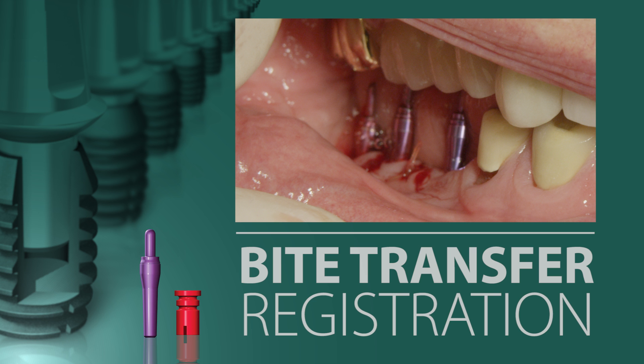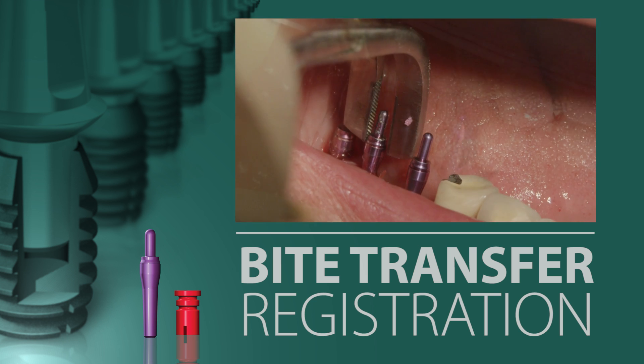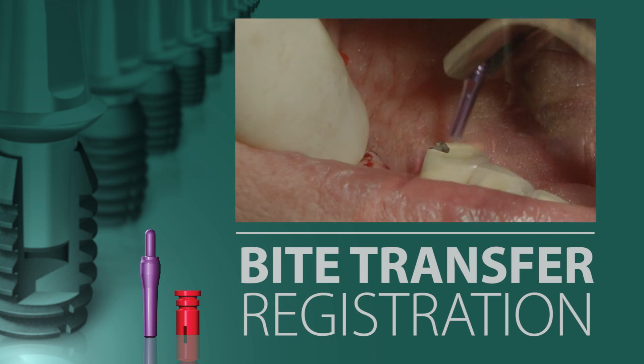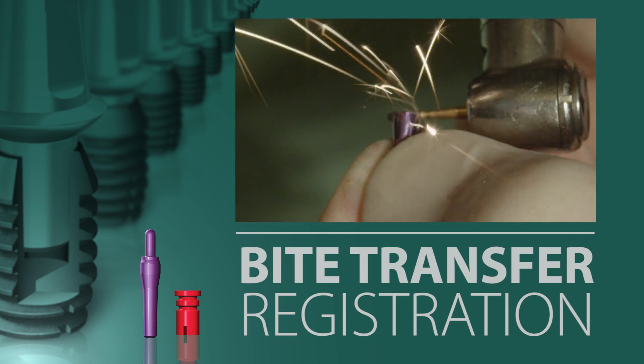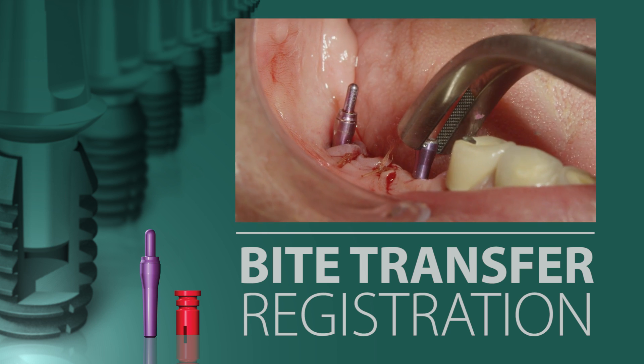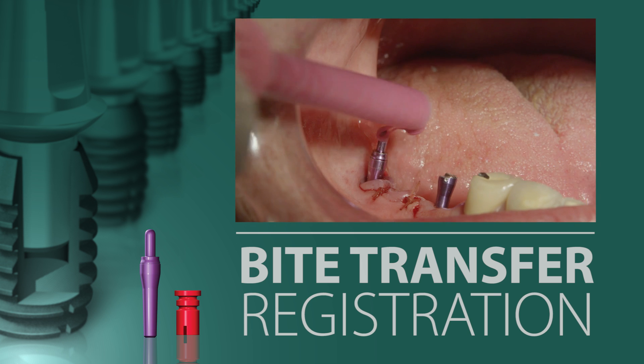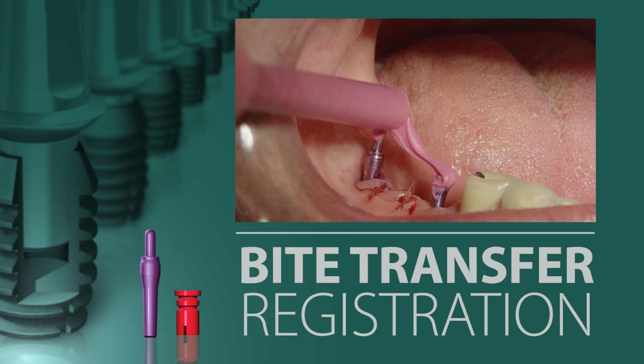Therefore, in this case, one impression post is removed, while the mesial impression post is modified with a burr to allow for clearance. The modified impression post is then placed back into the well of the implant and a polyvinyl siloxane or resin bite registration material is applied to the post.